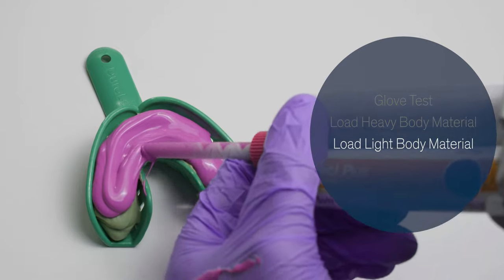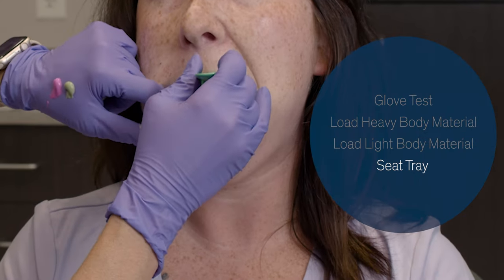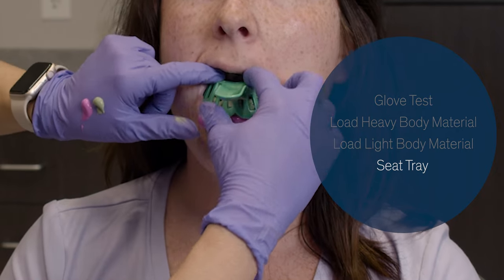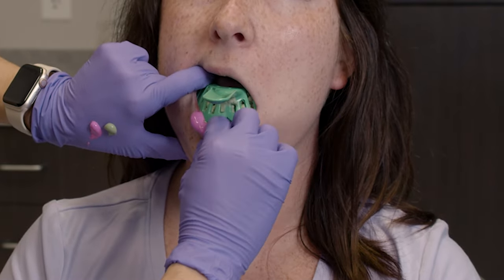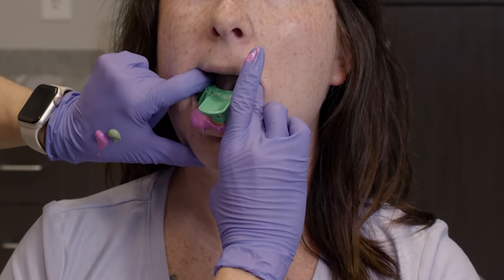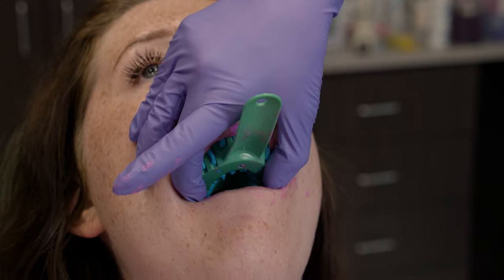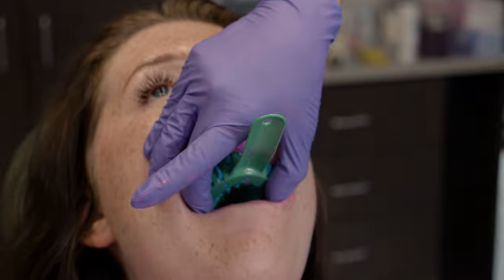When seating the impression, you want to seat the back of the tray — seat those molars first — and work your way to the anterior region of the mouth. Before you fully seat the anterior region, it's important to move the lip out of the way and then fully seat the tray in the anterior region as well. You'll want to use the two-finger technique in the mouth, applying medium pressure through the duration of the setup time.